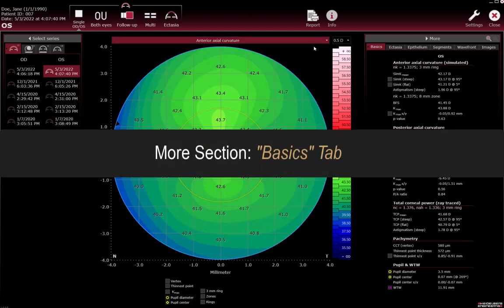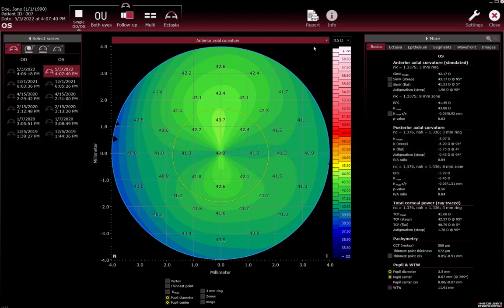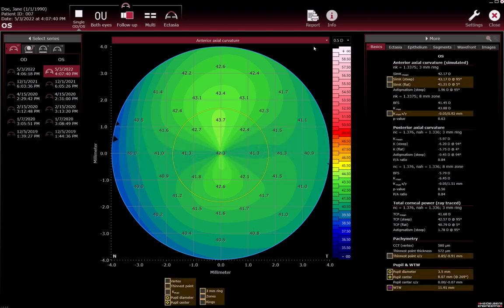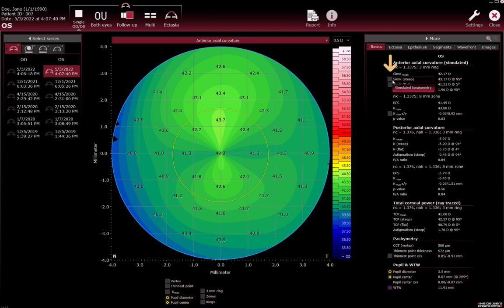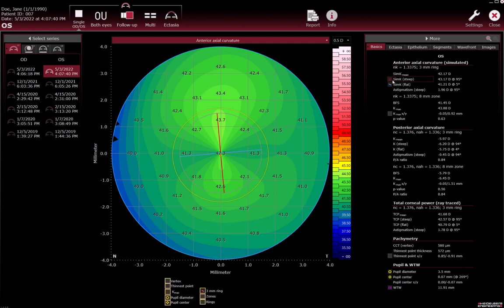In the More section Basics tab, various parameters can be superimposed as overlays on images and colour maps. Select the checkbox next to the overlay. Find the overlay checkboxes next to the parameters on the various tabs in the More section at the bottom of the single OD/OS view. Switch the unit of measure from millimetres to diopters or vice versa by right-clicking anywhere in the window.